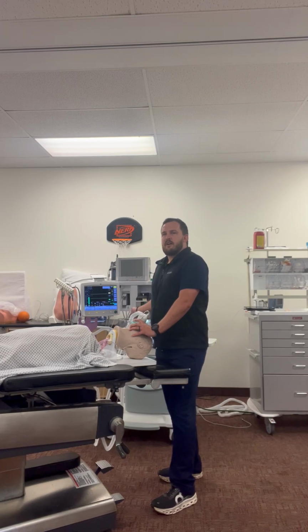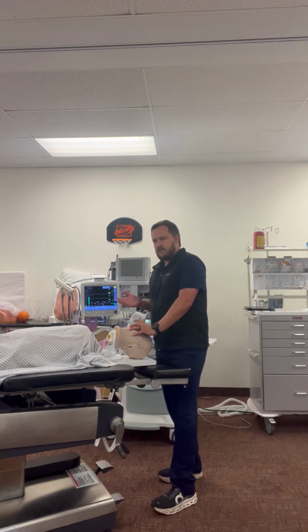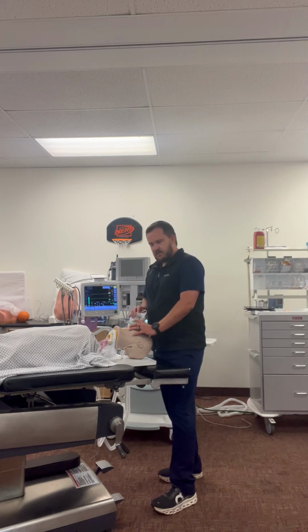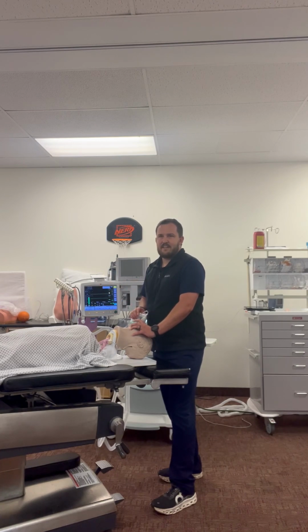I'm gonna put my oxygen to 3 liters, my nitrous up to 7 liters. If the patient's calm, I can put my sevo to 2% to start and then slowly increase up to 8%. If at any point the patient becomes uncooperative before I hit that 8%, I'm just going to perform an SLB, increase my sevo to 8%, and hold on until he goes to sleep.